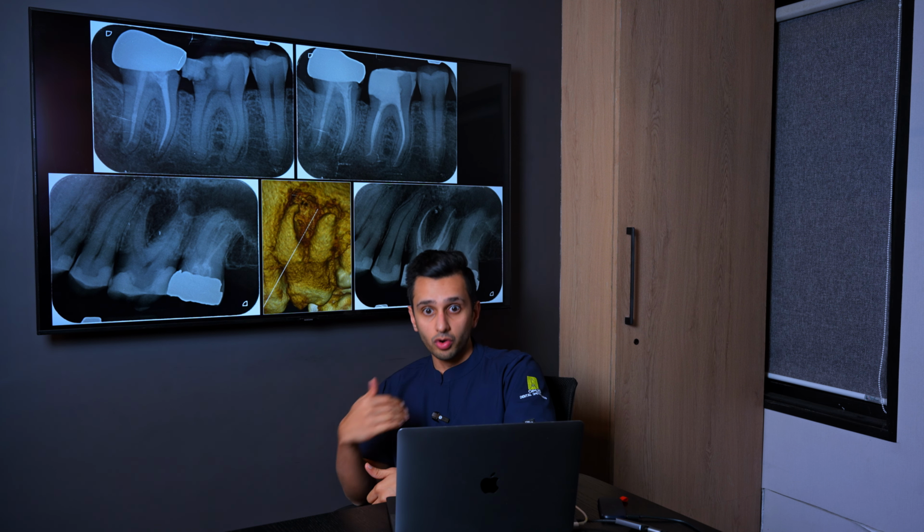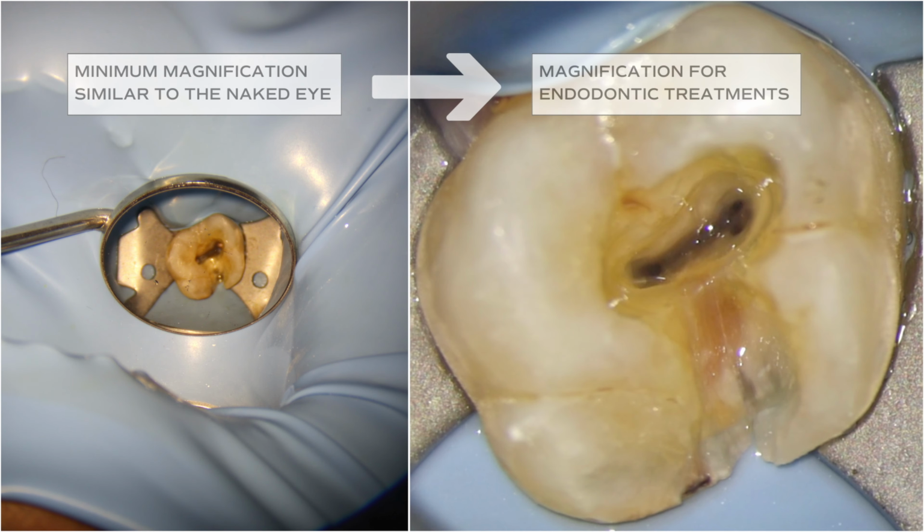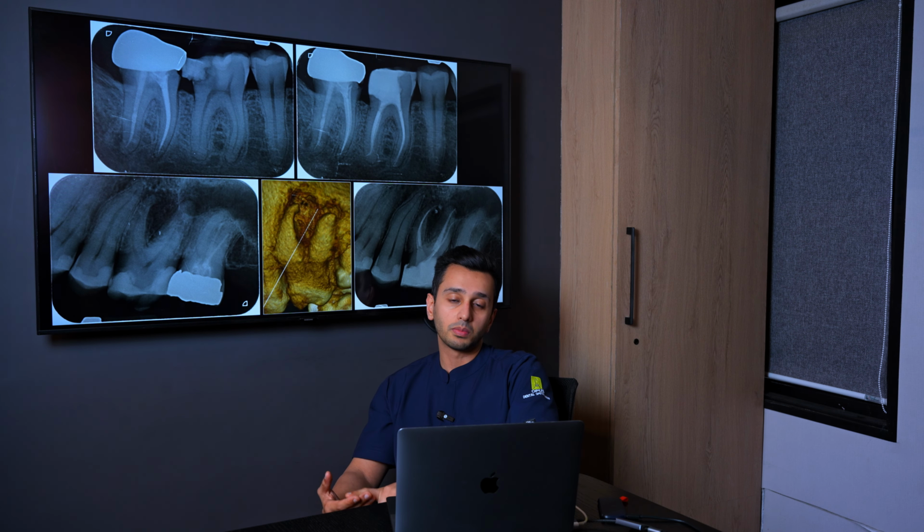I use it for all root canal treatments and surgical procedures, but also for basic diagnosis as well. Because there are a lot of things that your naked eye unfortunately cannot pick up, and a microscope enhances that by 25x. So you get to see much more clearly, and you pick up things that will impact the diagnosis, your treatment, and inevitably the outcome of the treatment as well.